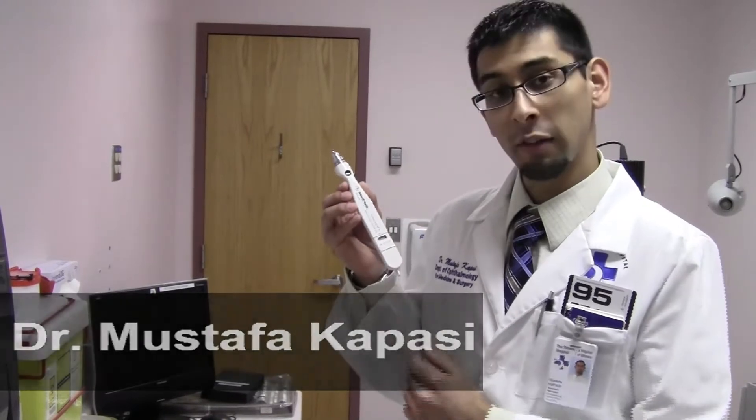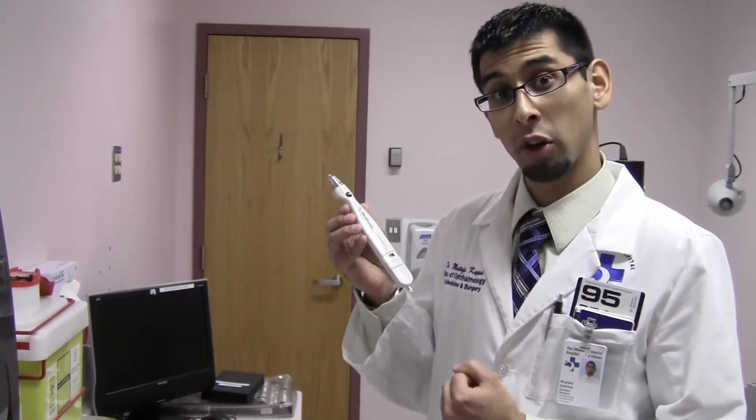Hello, we're going to talk about how to use a tonopen. A tonopen is a portable device used to measure intraocular pressure.